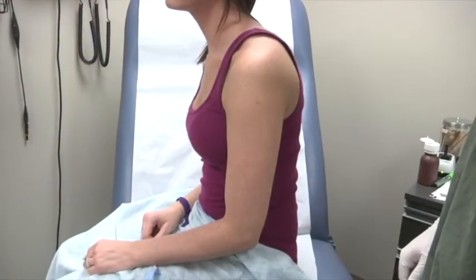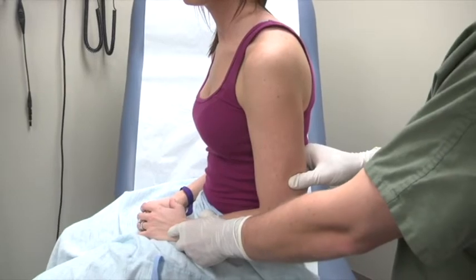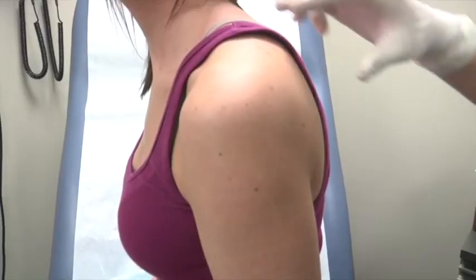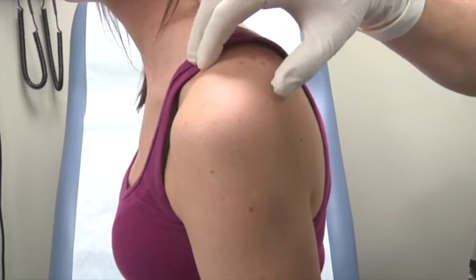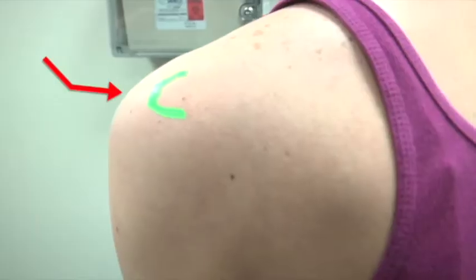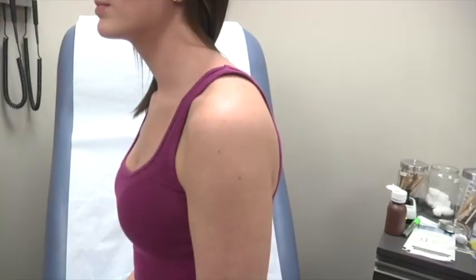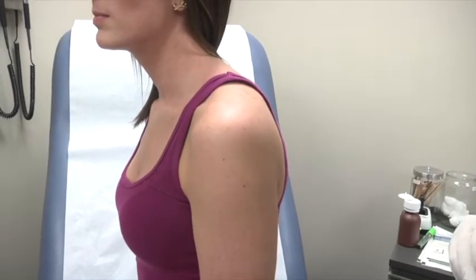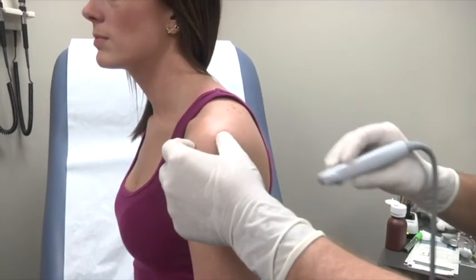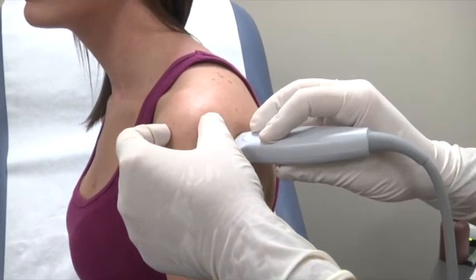For the posterior approach, the patient should be placed in a sitting position with the elbow flexed and with the forearm resting at the side in a neutral position. Palpate the shoulder to identify the acromion at the lateral limit of the scapular spine. The transducer is placed in transverse orientation approximately 2 to 3 centimeters inferior and 1 to 2 centimeters medial to the bulge of the posterior acromion.